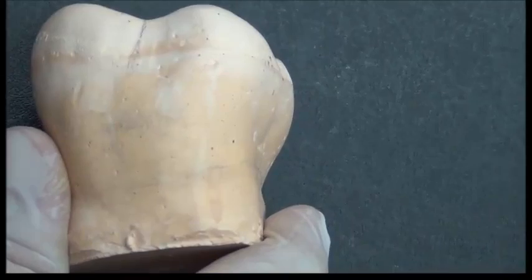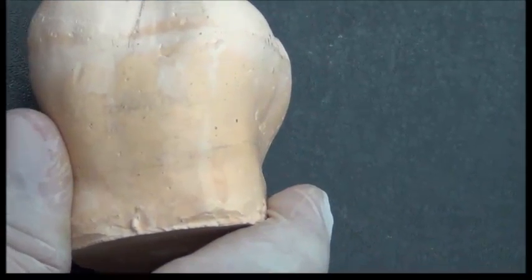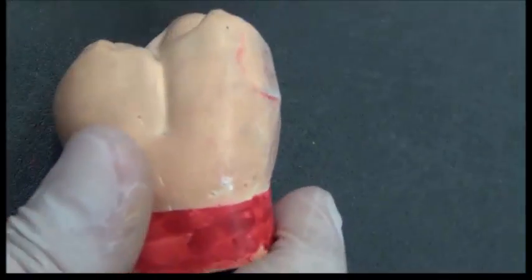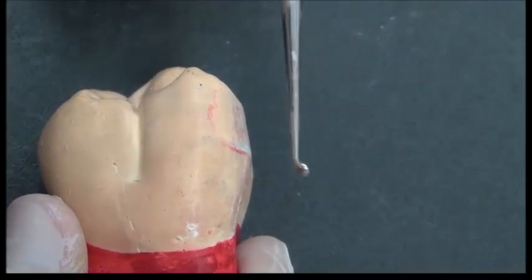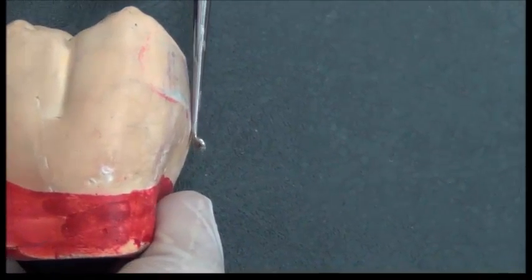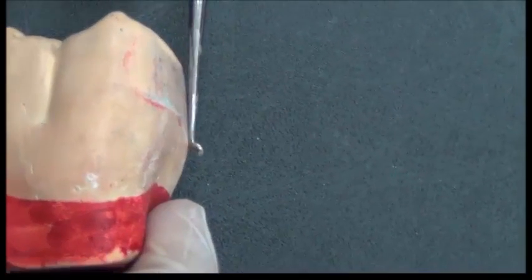So how do I do that? By carving in a flat area on this proximal surface. So using a burr on high speed, I could reduce slightly the enamel on this proximal side, and this makes this enamel area flat.